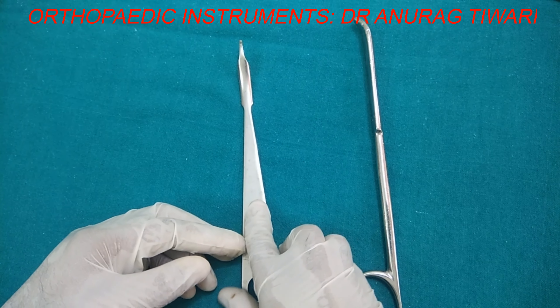Bone levers or bone spikes are used to retract and deliver the bone out of the surgical wound for easy access. For example, during femur plating, the bone lies deep in the wound. You apply the instrument against the bone and give pressure to bring it out. A specialized type is the Hohmann retractor; the other is the simple bone lever or bone spike.